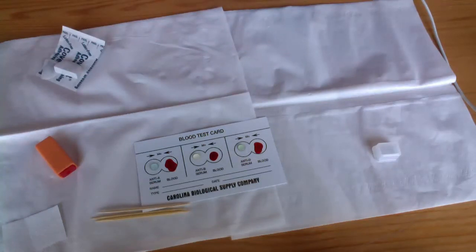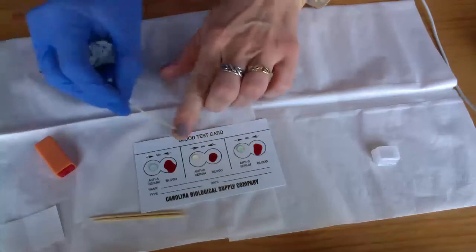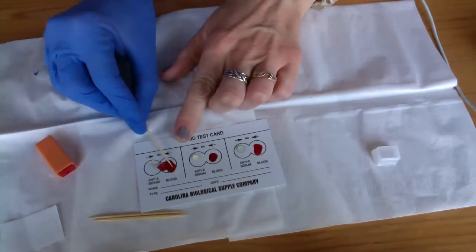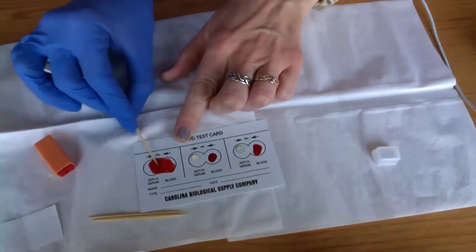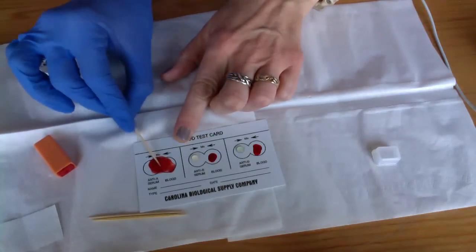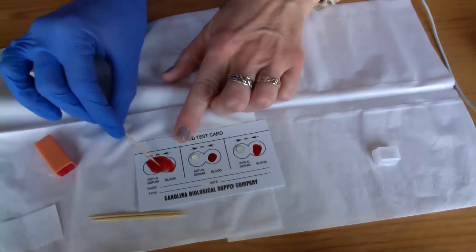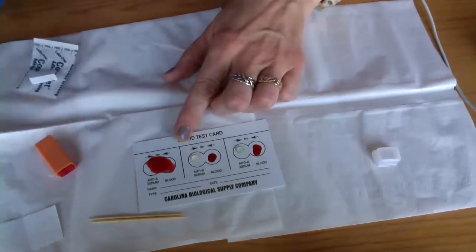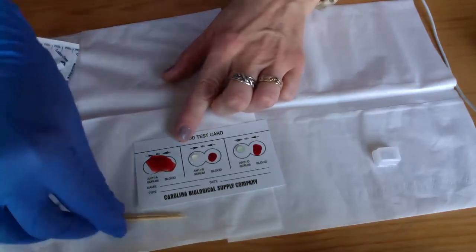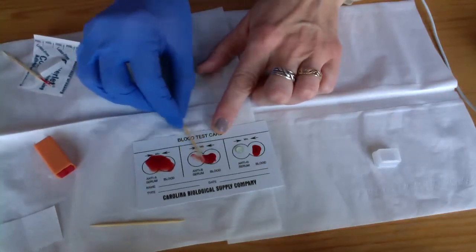And so now I'm going to take my toothpicks, and I'm going to go ahead and mix. I have 3 toothpicks because you don't want to mix the two, right? I don't want to mix the anti-A serum with the anti-B serum because that could ruin your test results. So I'm going to mix each one.